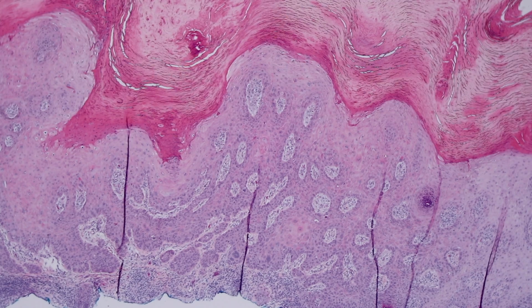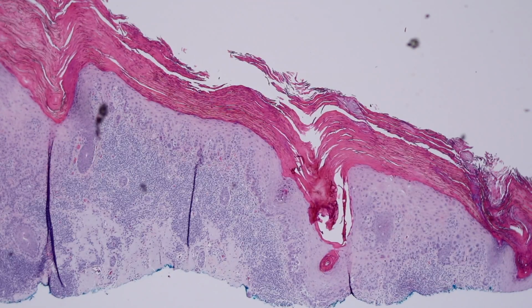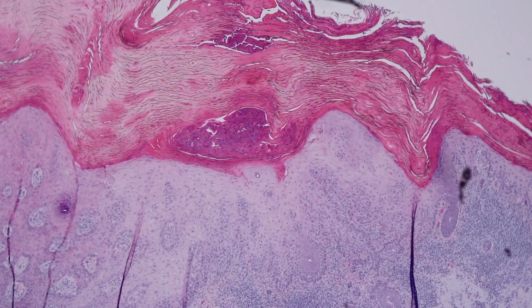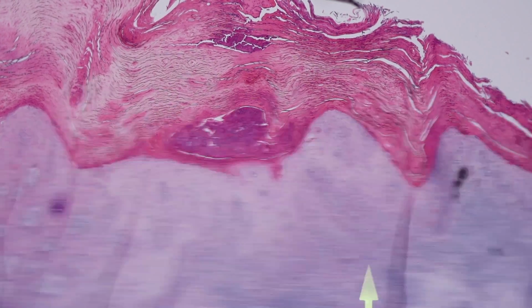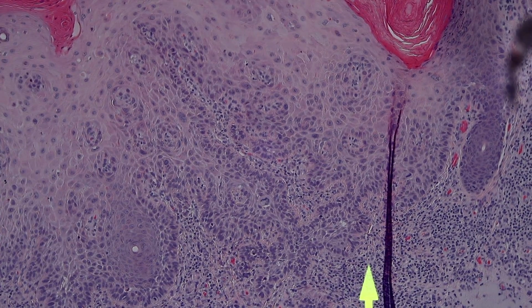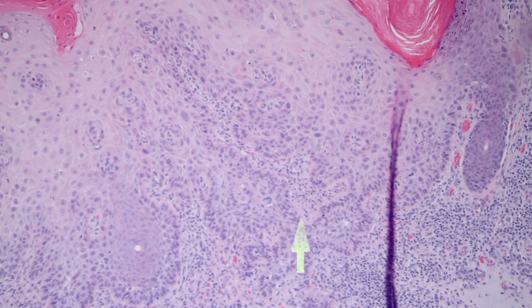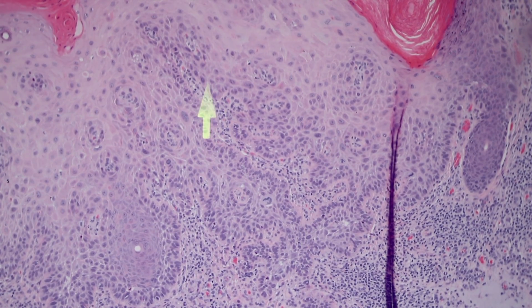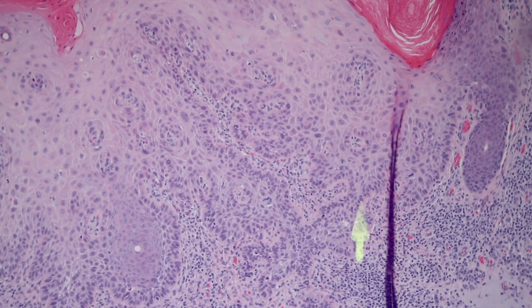Here's another case like this where we've got nice hypertrophic actinic keratosis. It starts kind of budding down and pushing down, like right here. So is that invasion? Well, it kind of looks like it, right? But be a little bit careful here because we're kind of tangentially cutting or obliquely cutting through the tissue. And you can tell because we've got little islands of entrapped papillary dermis. There's little islands here.